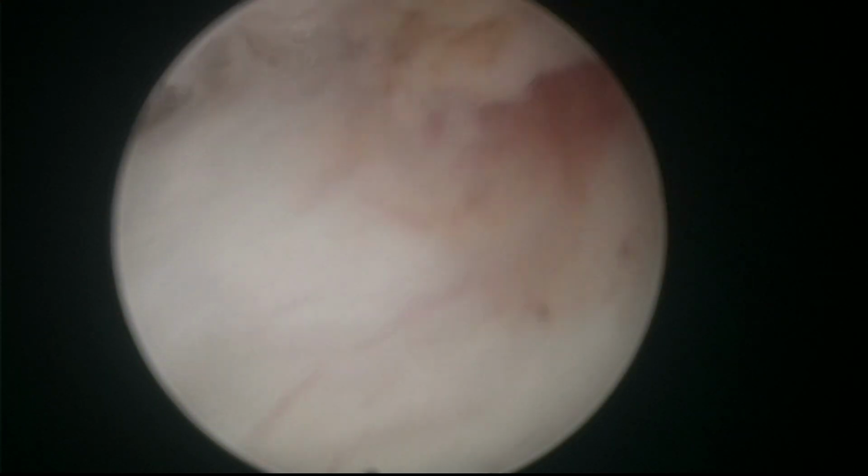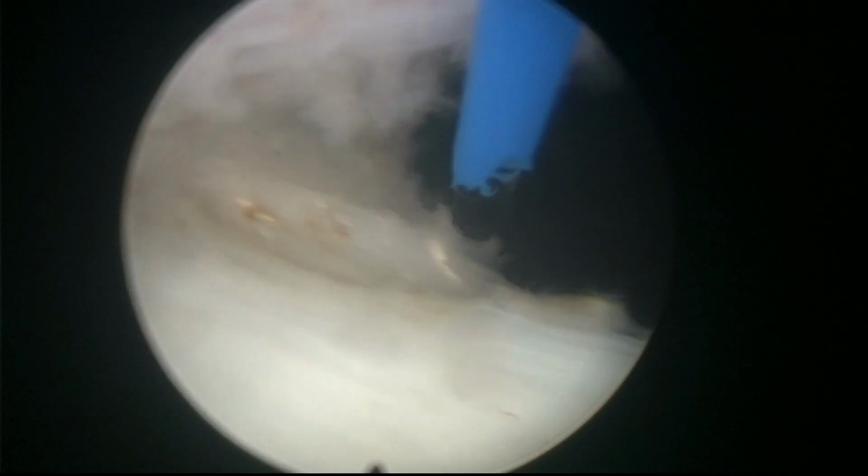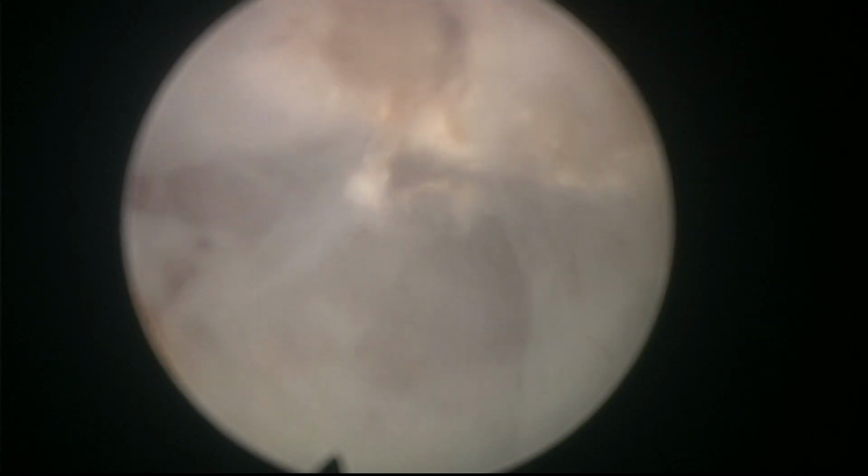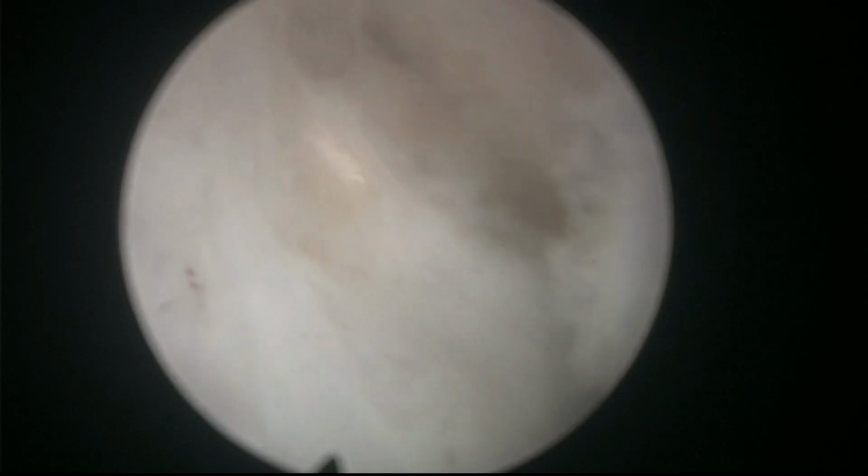You know, don't be so stubborn to remain in one difficult area and try to finish that, you see, because here we are under the bladder neck, almost finishing the procedure, the enucleation part. Let's see where we are. Here you see there's only a little bit of attachment down here. So let's again gain 1 millimeter at a time, and where you are, do it confidently. You don't have to do anything you don't believe that it's the right thing to do. It seems obvious, but don't try stupid things, just stick to the plan, stick to the method.